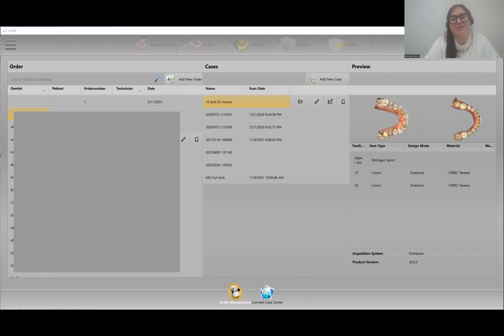Today, we're going to take you through a virtual training, which is your initial onboarding for the Dentsply inLab solution. So thank you so much for joining us for this digital journey, if you will.